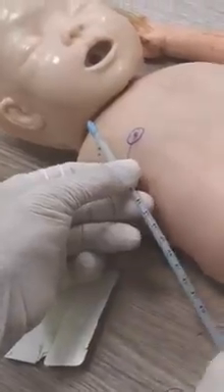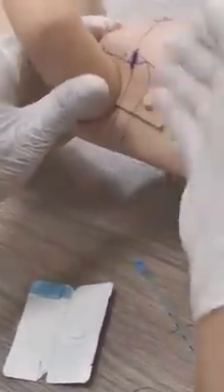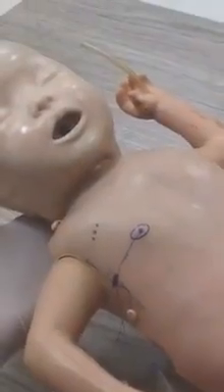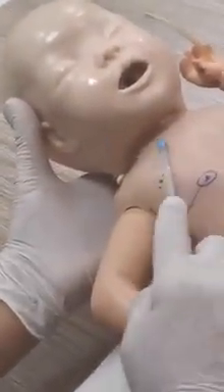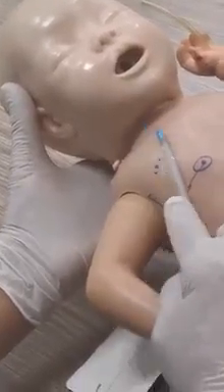The second tip also: some advise, before insertion, to rotate the patient to the left side to make the air go up, so it will be easy for you. After insertion also, if you see the pocket of air still down, you should position your patient at least 45 degrees, so the air will also go up and the ICD can drain all the air.